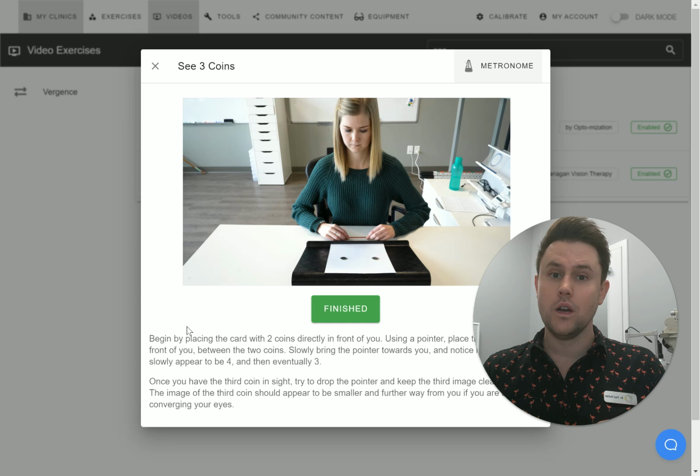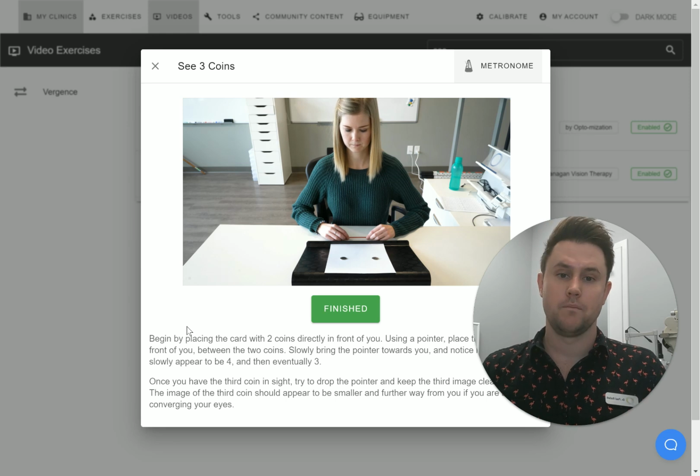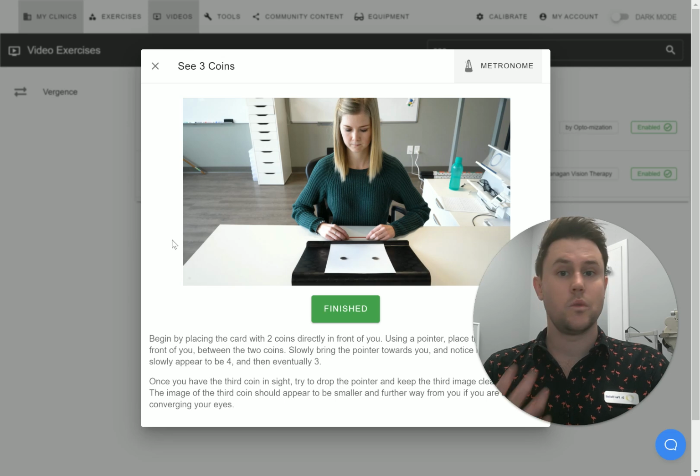But once they do, there's often big breakthroughs, and then you can start moving the target. You can get fusion while you're moving. It's a way to tell your eyes or teach your eyes how to look where you want them to. So this particular video we find really helpful. Feel free to take a look at it and again, use it with your team, and you can use it with your patients.